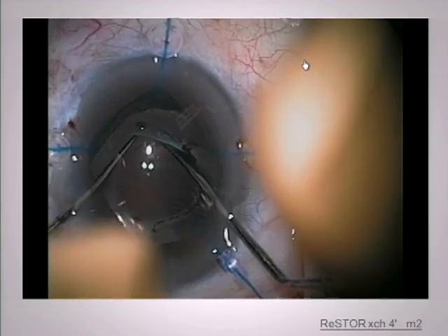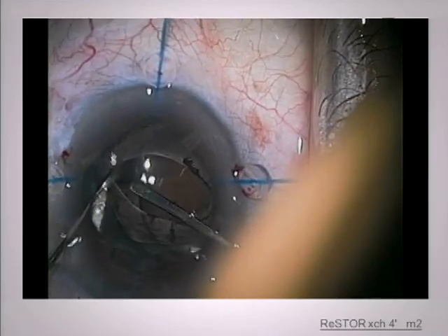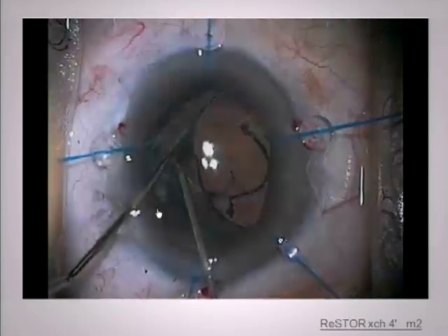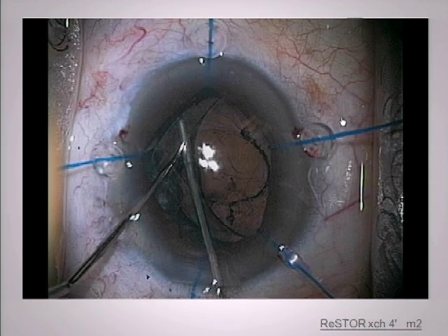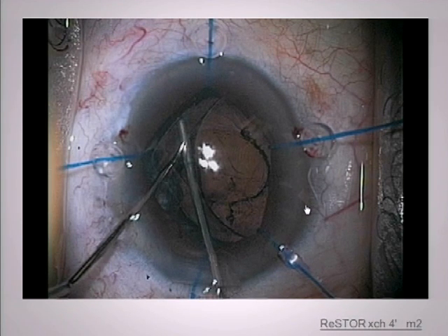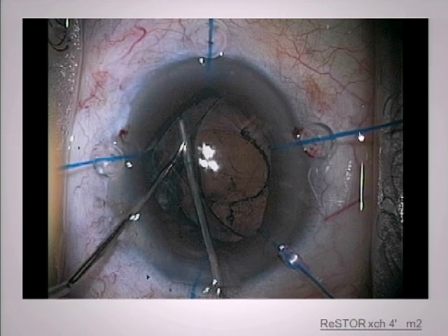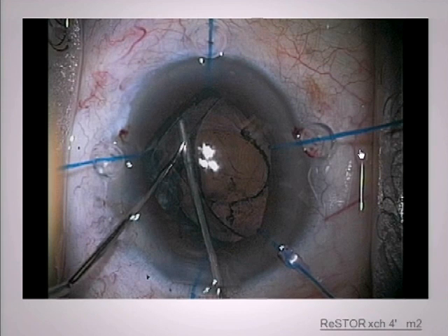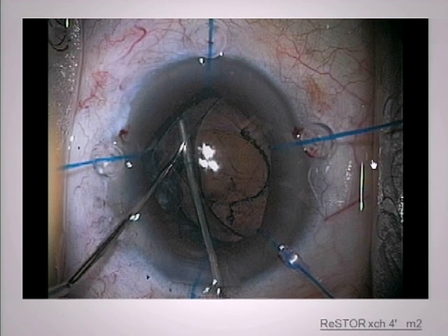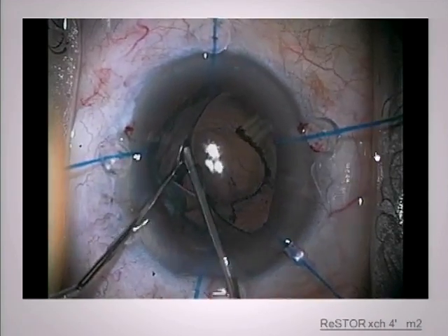I'm trying to mobilize it, and what I'm seeing is that this haptic right here is pretty much stuck. Typically after a year or so, that little bulb tip on the end just seems to get fibrosed in, and there's a little tunnel here. You can do a couple things: you can take your viscoelastic, start at the end, and go directly out and try to free it up, and then sometimes use MST forceps to hold it and pull — not centrally but peripherally — to break it. Or you can just cut it and leave it.